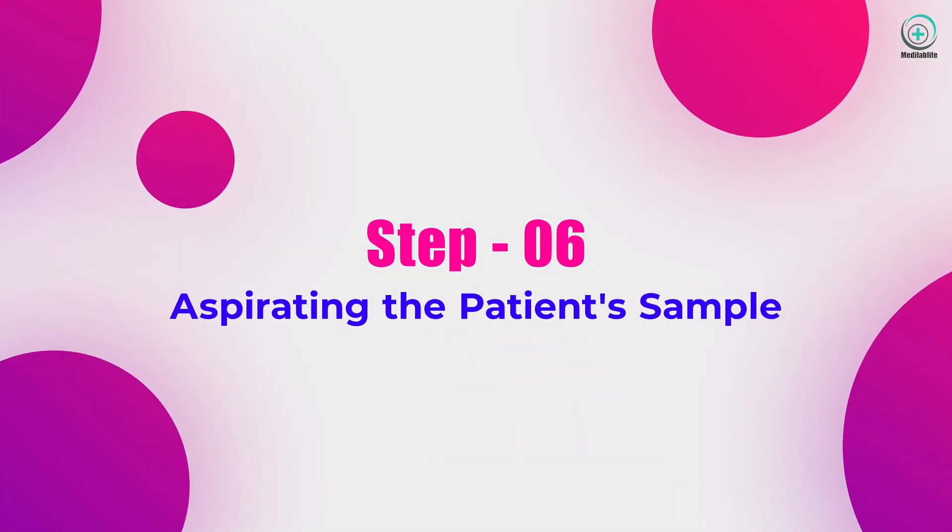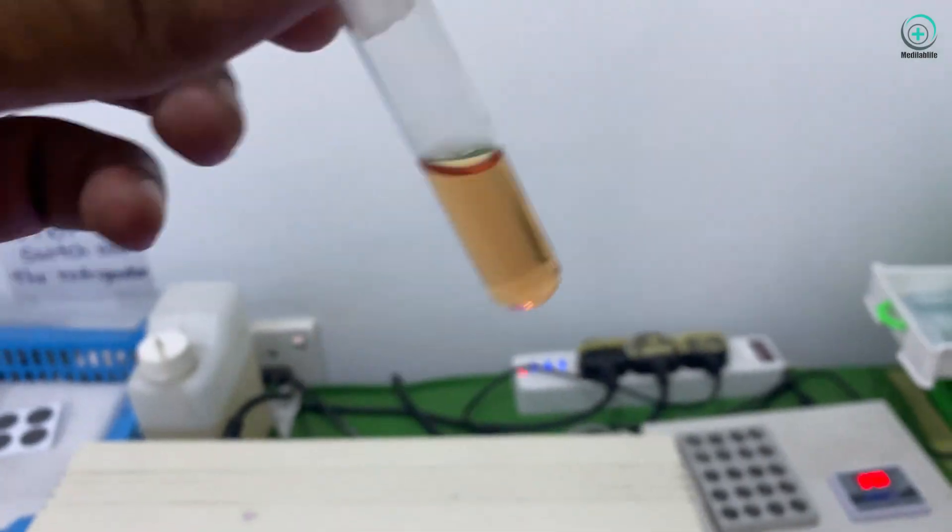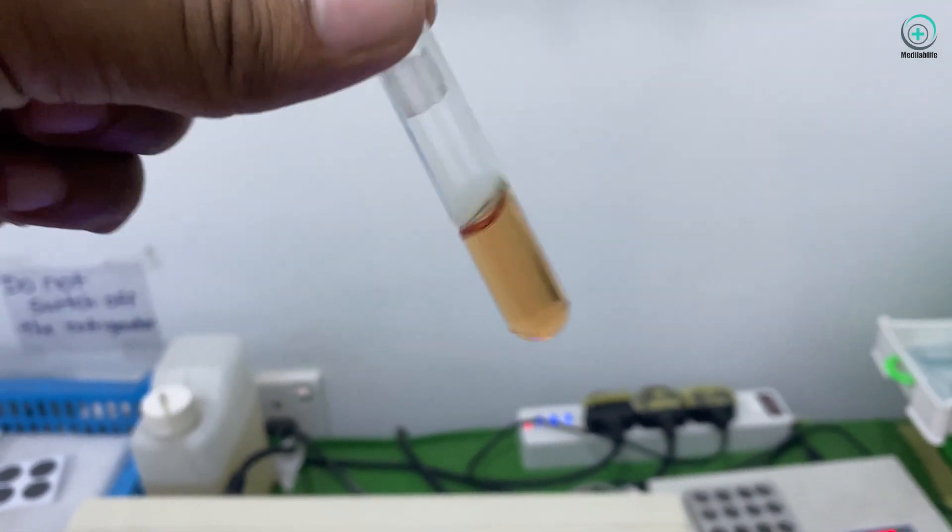Step 6: Aspirating the patient sample. Aspirate the con tube containing the patient's blood sample mixed with reagent using a micropipette.